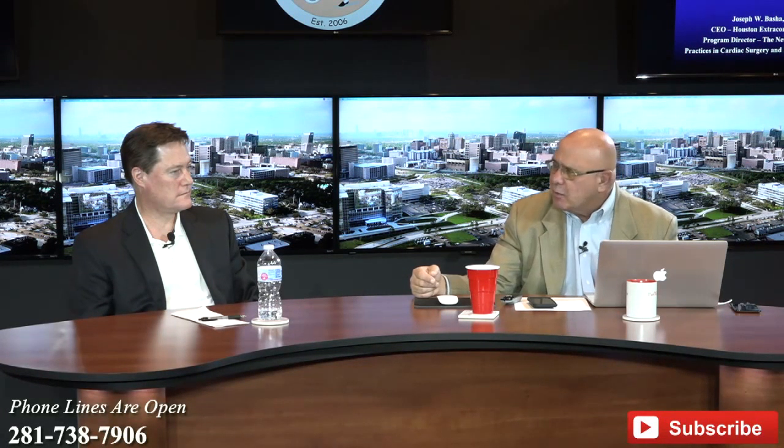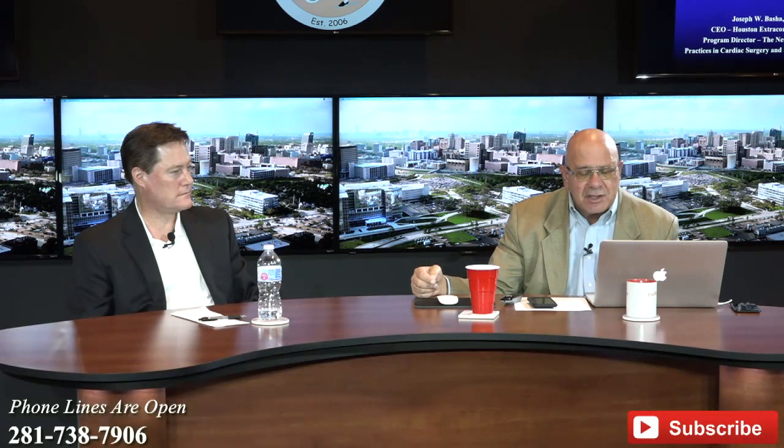And then I'll just quickly deal with this. Our solution was to use ECMO circuit to hemoconcentrator, return to pre-existing SLIC in IJ. I'm not sure I know what that is. SLIC in IJ, unless he means IJ, not IG. Andrew, I can't quite figure that one out, man. Ask me that one again.